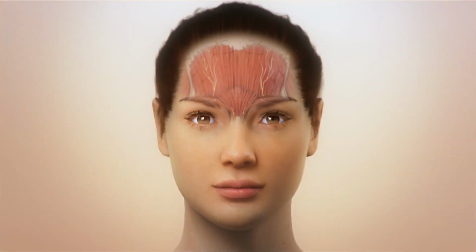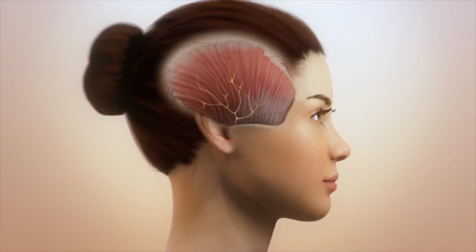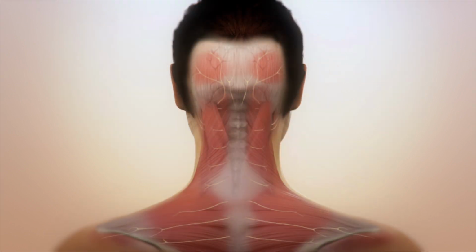This injection paradigm provides optimal distribution of Botox to the muscles that align with the peripheral sensory afferents of the trigeminal and upper cervical nerves. These muscles, along with bony structures and other features that are easy to palpate or visualize, serve as anatomical landmarks to help identify these specific injection sites.